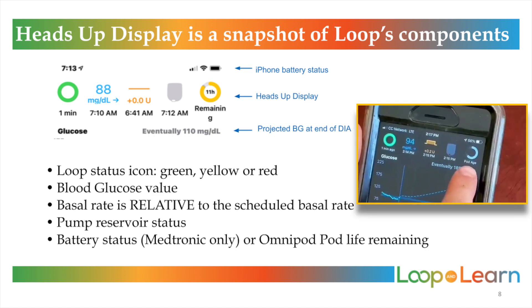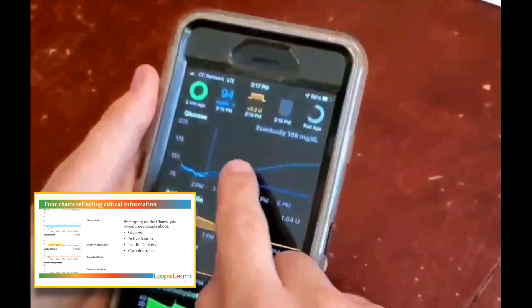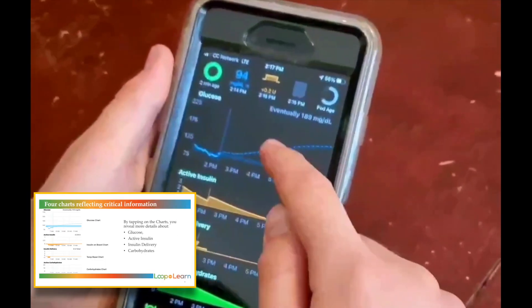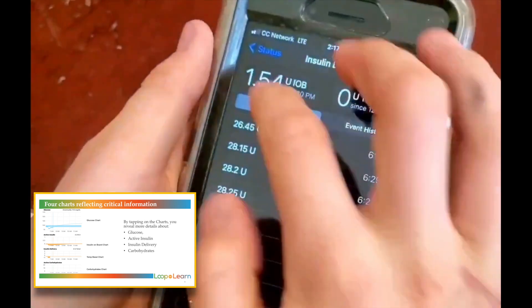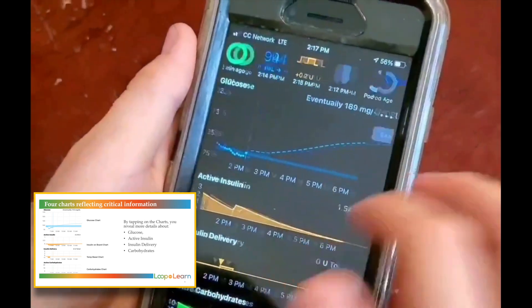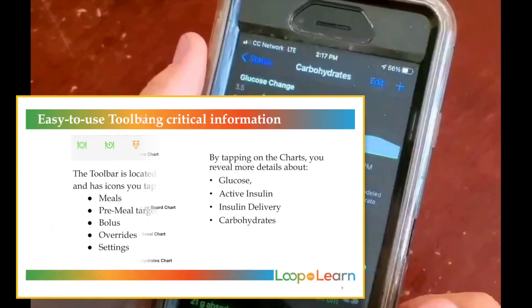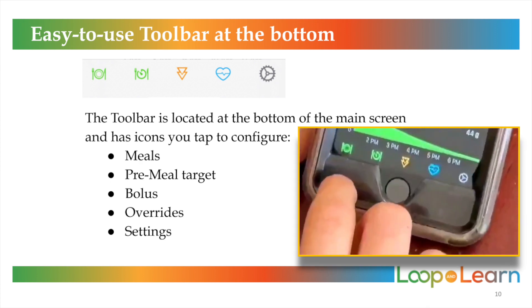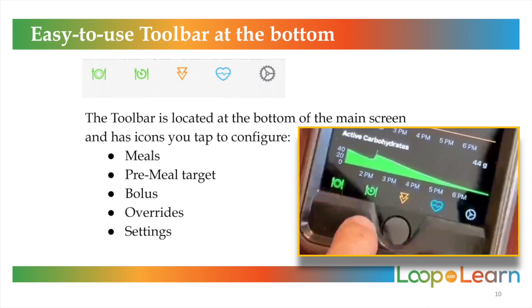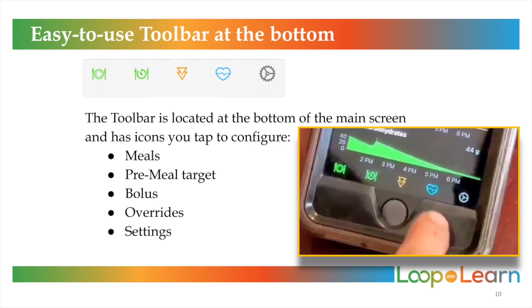This is the battery status for Medtronics, but I have an Omnipod, so instead it's the Omnipod Pod life. By tapping on the charts, you reveal more detail about glucose, active insulin, insulin delivery, and carbohydrates. The toolbar located at the bottom of the screen shows meals, pre-meal target, bolus, overrides, and settings.